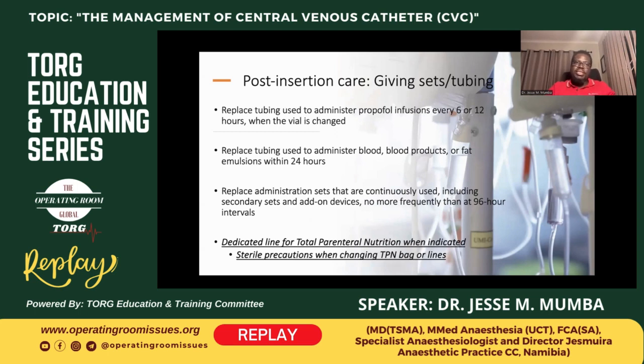We're so serious about TPN because it's a very good culture for bacteria. So even when the patient is coming to theater from ICU, I normally tell the staff not to disconnect the TPN bag. They can disconnect all other lines that are not needed, but the TPN, we just leave it on and we move with the patient, because we don't want to introduce any bacteria in there which can easily grow, because TPN is a good culture media.